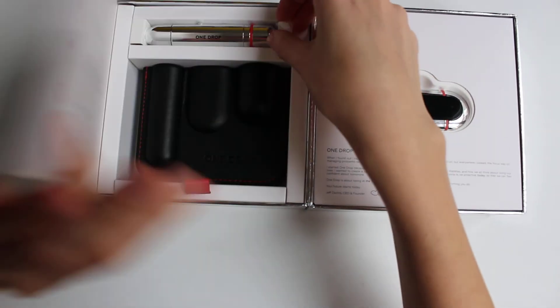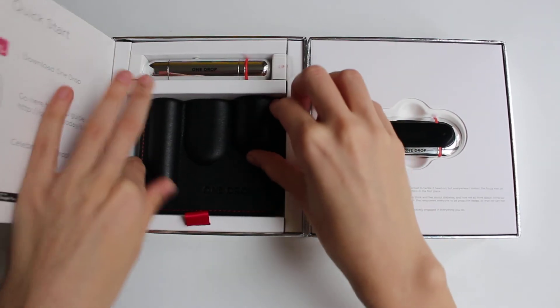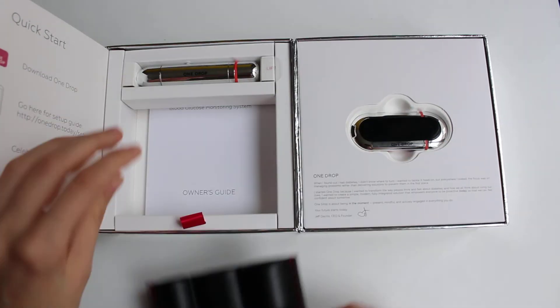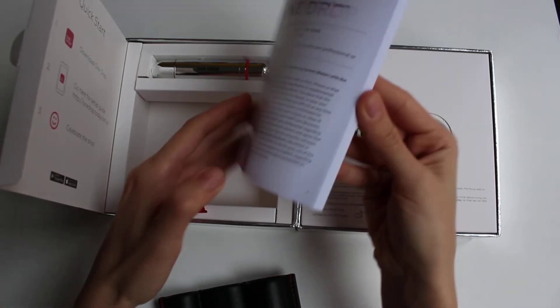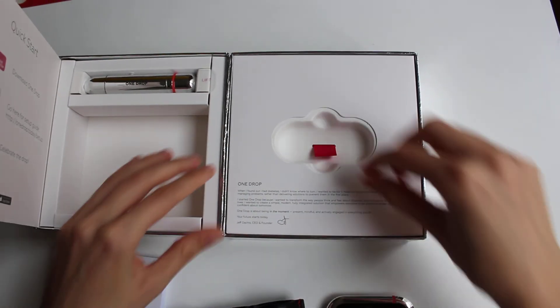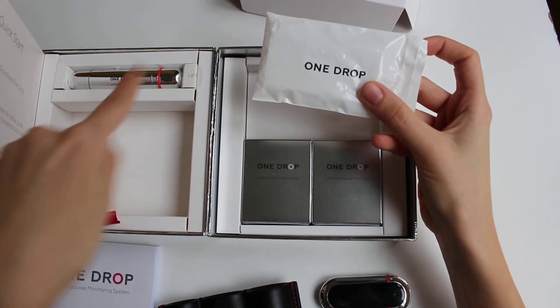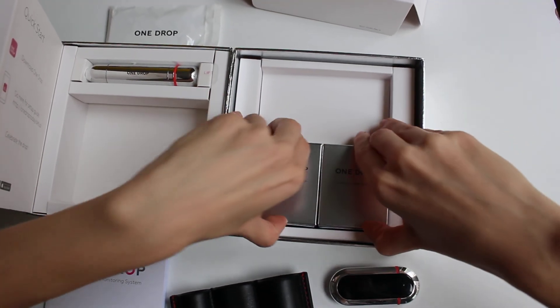Here we have the lancing device. It looks like this. There's a case, and everything fits perfectly inside the container. We also have the owner's guide. And in this part we have the lancet that goes in the lancing device, and two boxes of test strips.